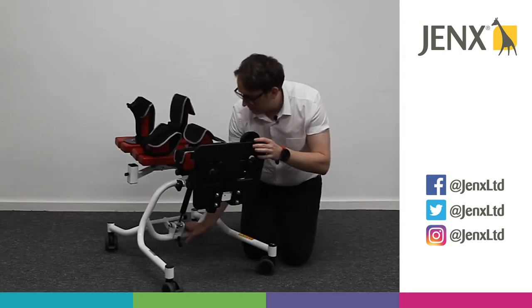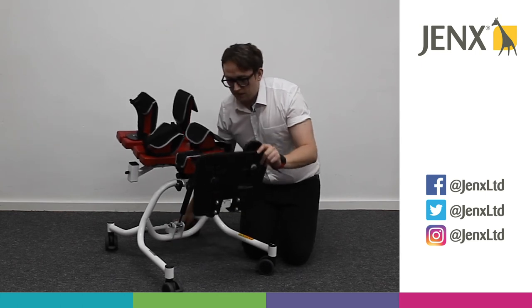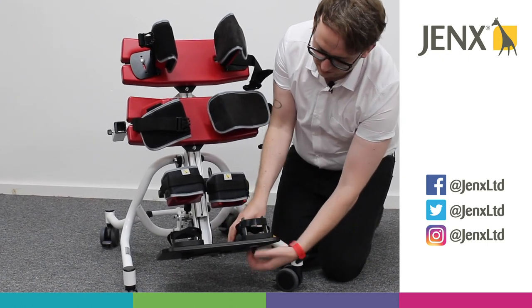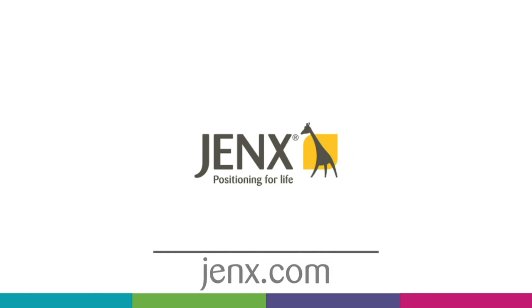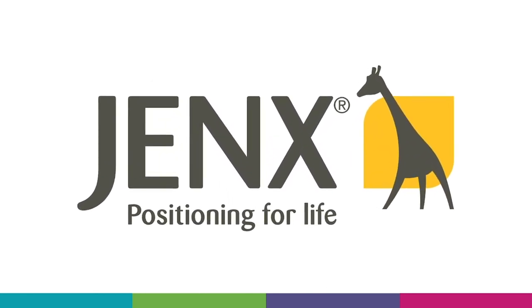Now, depending on whether you're using this stander in prone or supine, you may need to adjust the position of the sandal depending on which position the child is going into the stander.